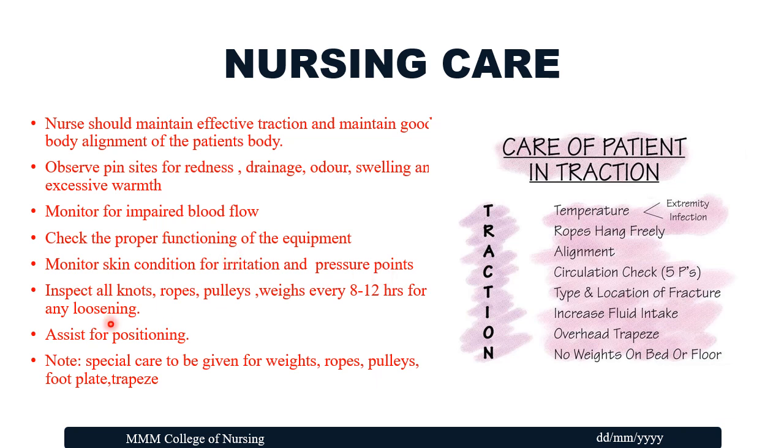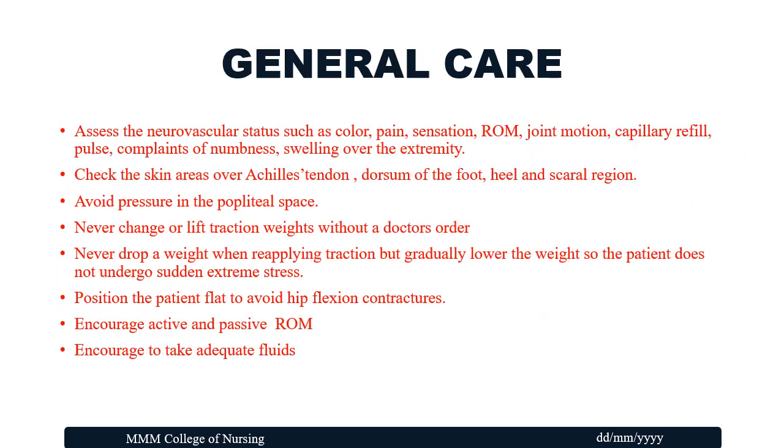Inspect all the knots, ropes, pulleys, and weights every 8 to 12 hours for any loosening. Assist with positioning. A special note: care is to be given to weights, ropes, pulleys, foot plate and trapeze especially. These are the nursing care.